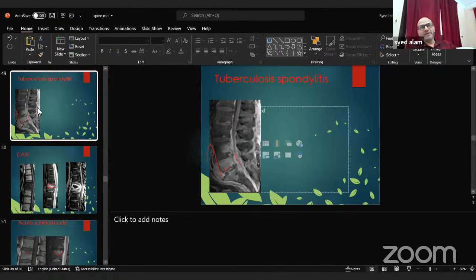You know better than me, L4, L5, you have to examine the patients. That is the importance. And if sometimes there is confusion, then we inject contrast and look for nerve root enhancement. Nerve root enhancement is a sign of abnormality, so the nerve root will be thick and enhance. These are sometimes helpful. Otherwise, it is a very difficult question.